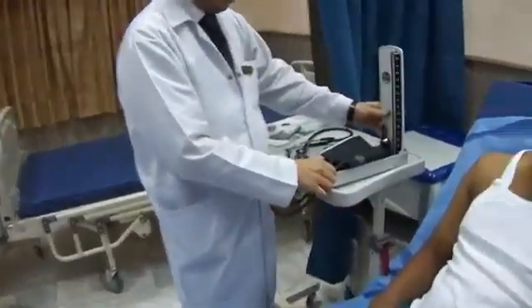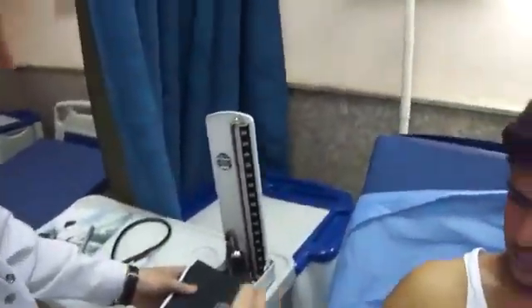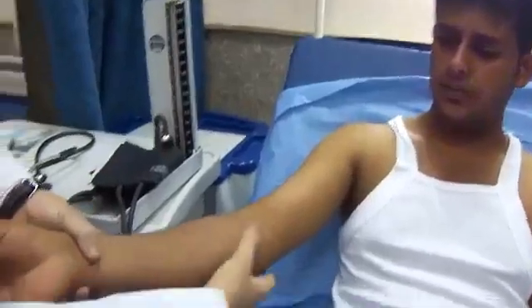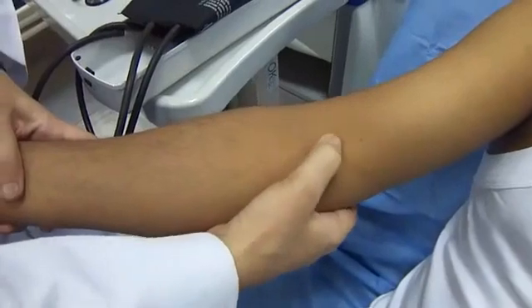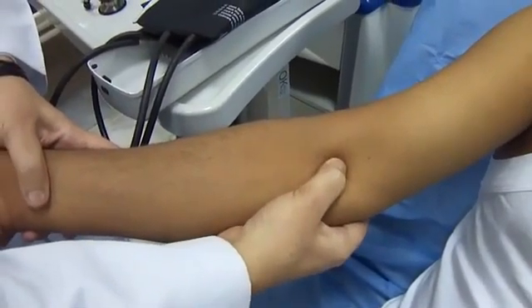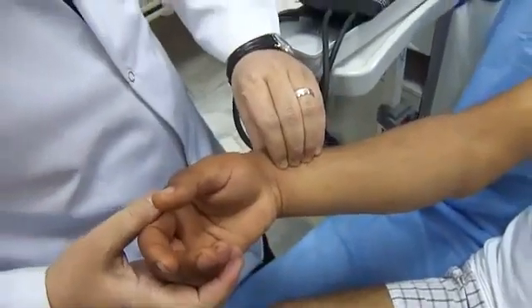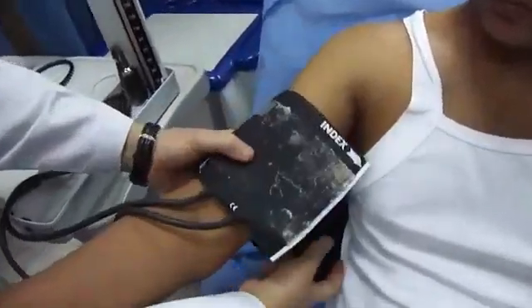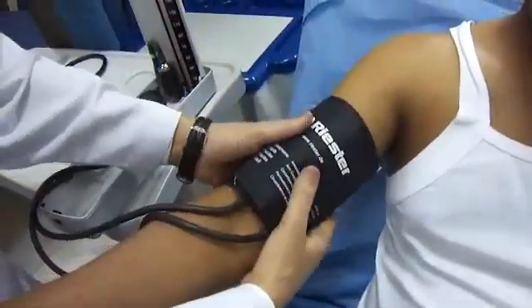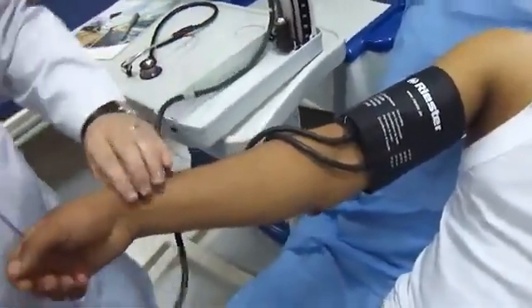First of all, I'll check the blood pressure on the right side. I'll place the sphygmomanometer at the heart level. I'll first locate the brachial pulse — this is the site of the brachial pulse — and I'll also check the radial pulse for its patency.